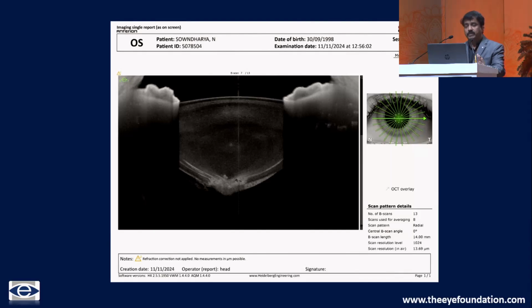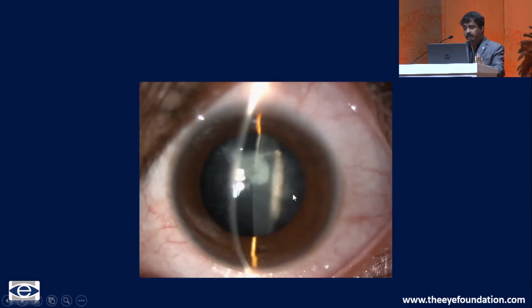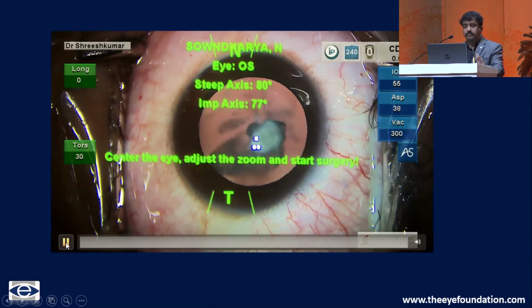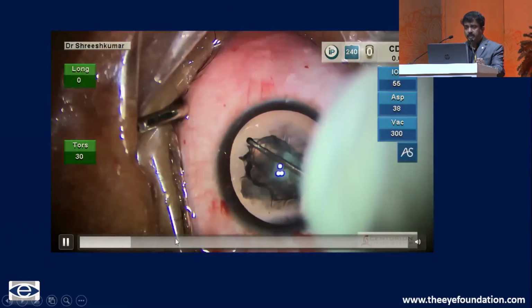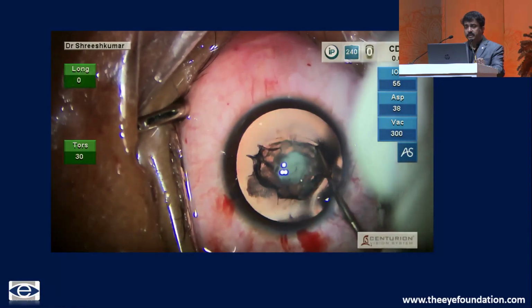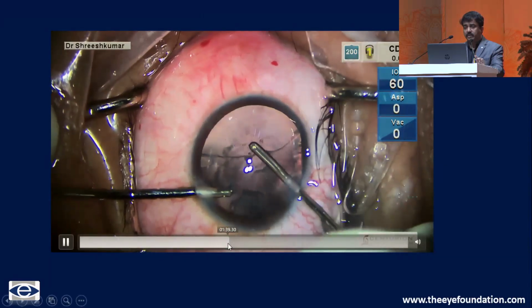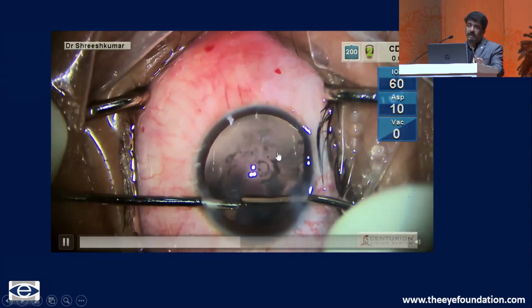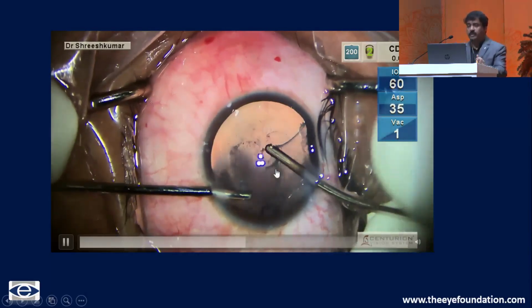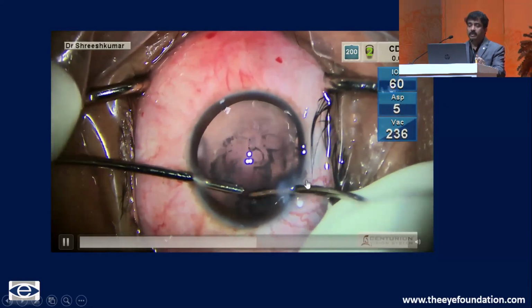Another case of PC defect, this is an obvious PC defect here, and this is the case. You could see the cortical debris in the patellar fossa. And again, I did mechanical delamination, moderate sized rhexis, and very soft cataract. You can aspirate it. That's what I have done here. You can see a defect here. This is a PC defect, but there is a lot of debris in the anterior vitreous face. This patient definitely requires anterior vitrectomy, even though there was no obvious vitreous prolapse from the capsular defect.